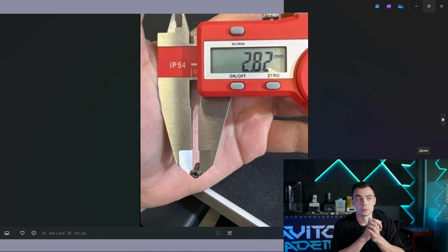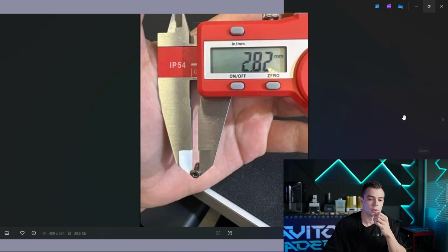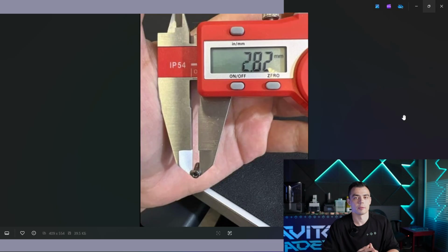According to our statistics, most of the problems occur during post-fabrication of surgical guides, and sometimes you can face such a situation when you have printed your surgical guide. It looks okay, it fits on the model, but the sleeves cannot be properly inserted into the guide. And sometimes it's also about sleeve manufacturers, because they can slightly increase or decrease the outer diameter of the sleeve.